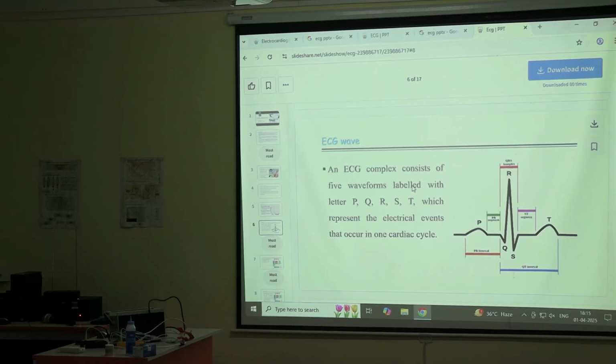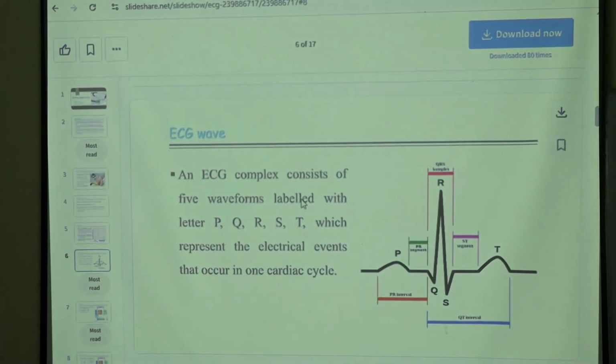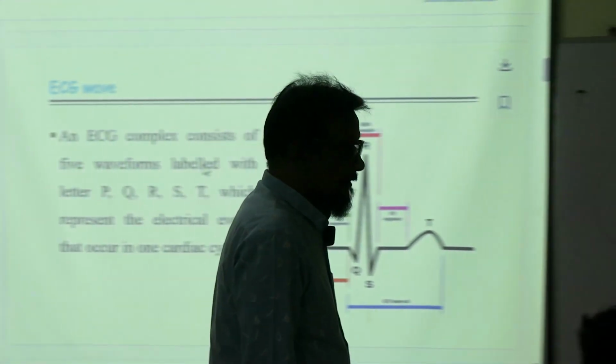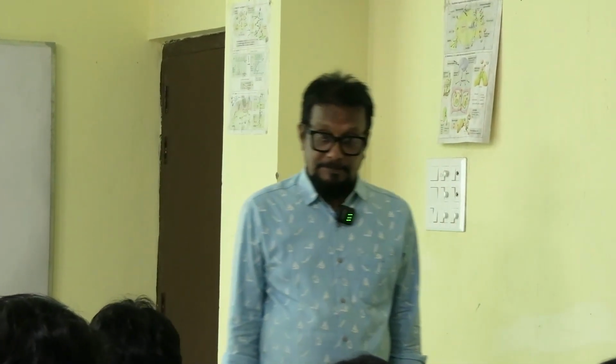I will take a short introductory class on electrocardiography. Electrocardiography. What is this procedure? Electrocardiography is a procedure. Procedure of what? Recording electrical activity of the heart.